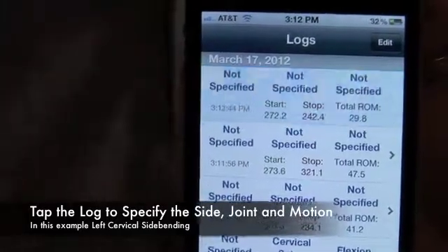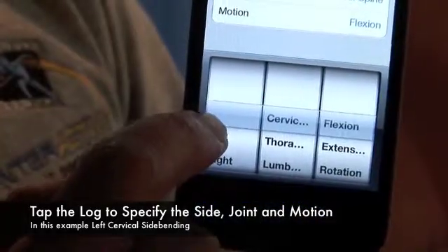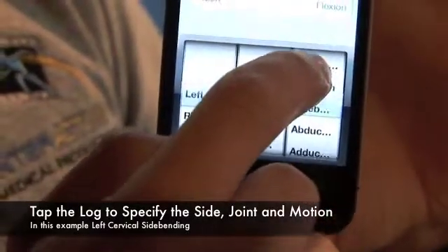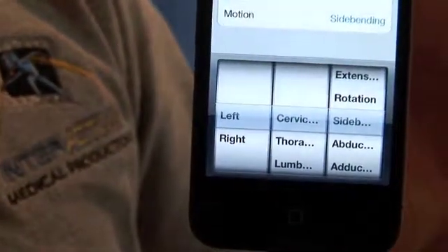Here you are able to specify what joint was measured, what motion, and what side of body. In this case, left cervical side bending.